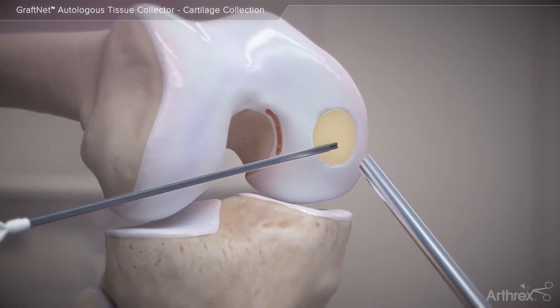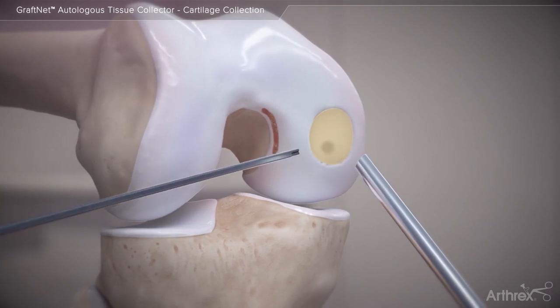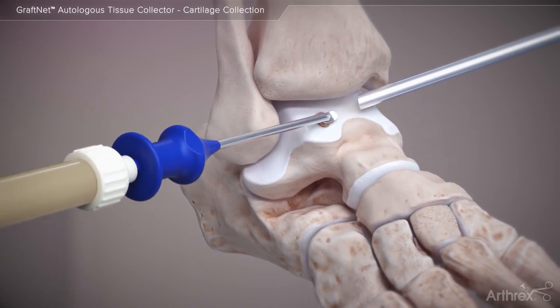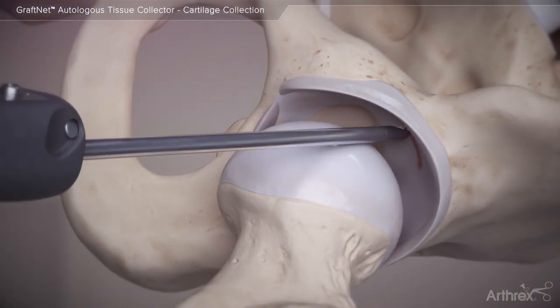The completed repair is then sealed with fibrin glue or autologous thrombin serum to stabilize the construct. The autologous tissue collected by GrafNet can also be used to repair chondral defects of the talus or acetabular cartilage defects in the hip.